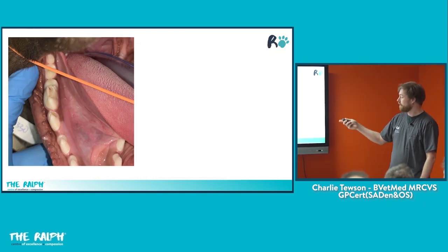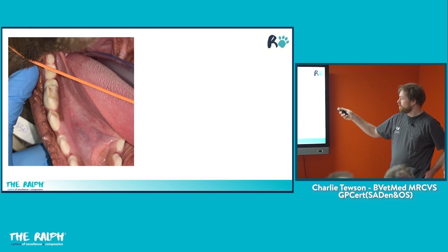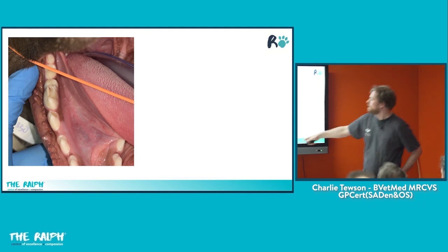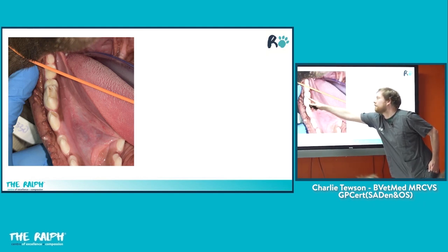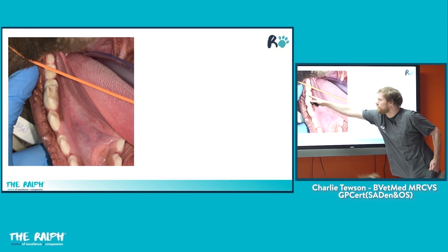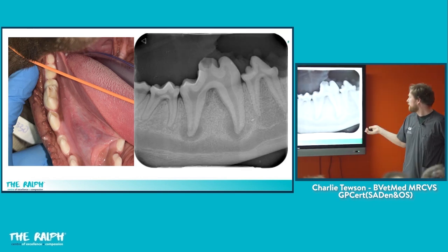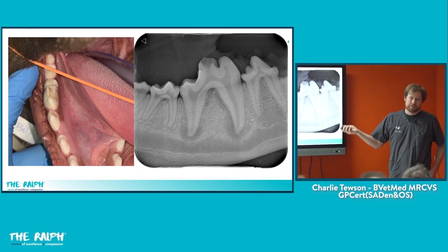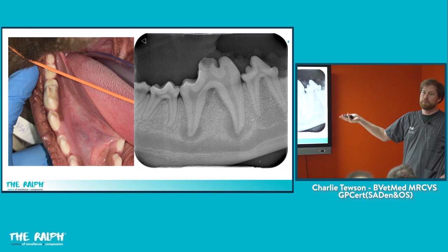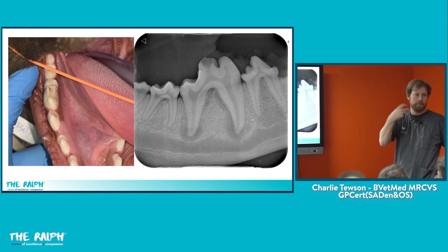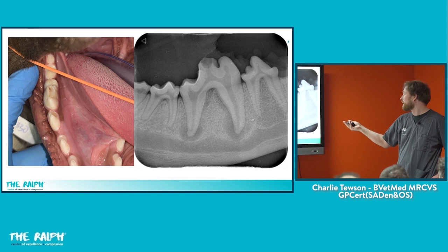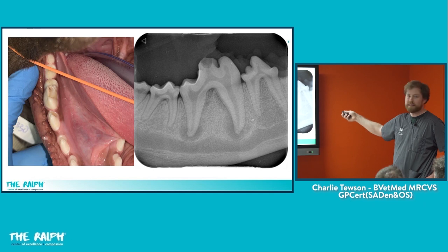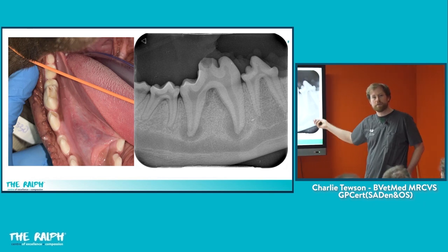This is the same dog looking at the rest of the teeth — the right mandibular carnassial or right mandibular first molar. There's a little crown fracture with a questionable pulp exposure there. Taking an x-ray, you can see big periapical lucencies. Again, this is just an incidental finding — this dog was in because we were doing a root canal on one tooth, which predisposed it to having crown fractures. I had no idea this was going to be this significant, and it's already causing a problem for this dog.